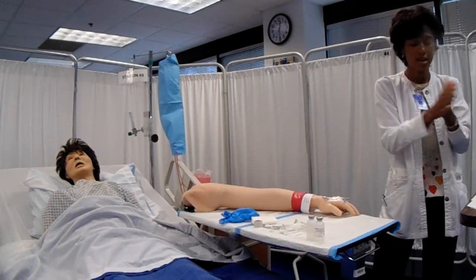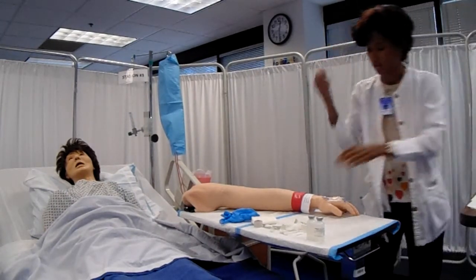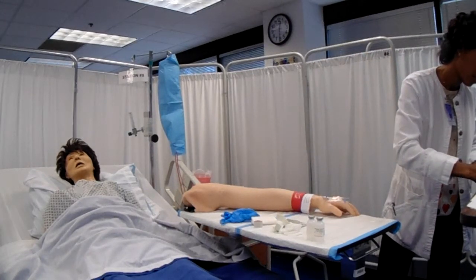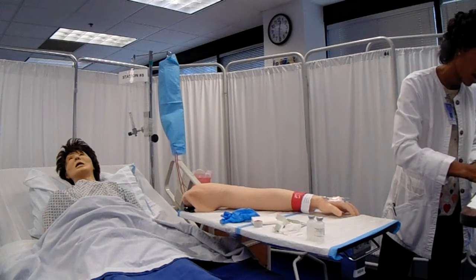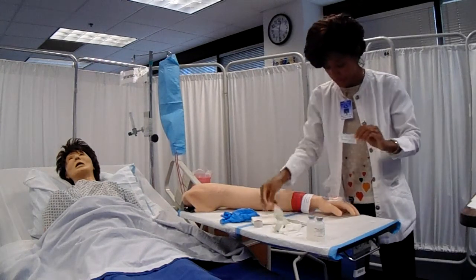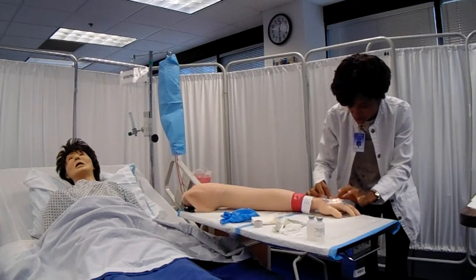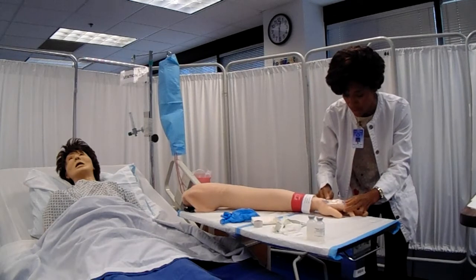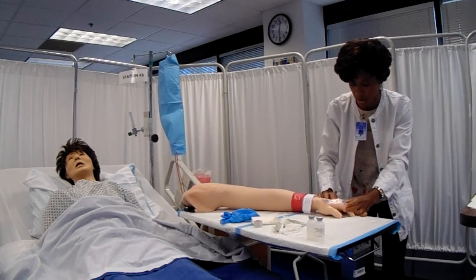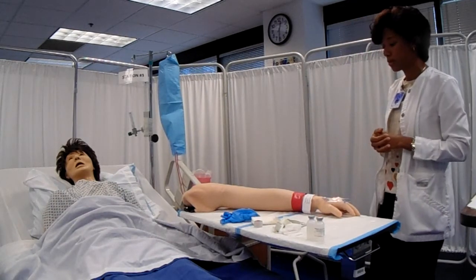I performed hand hygiene. I had my pen already out, and we'll write today's date, my initials, and gauge. And I'm going to make sure when I place the label that it does not occlude the op-site dressing, so we can always visualize the entry site for any signs of swelling, redness, or infection. Okay, great. You tolerated that very well.